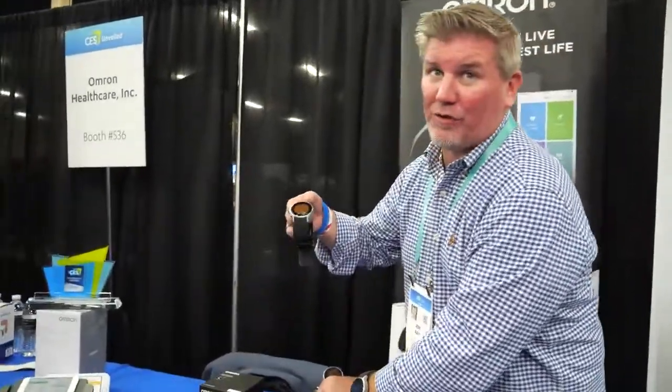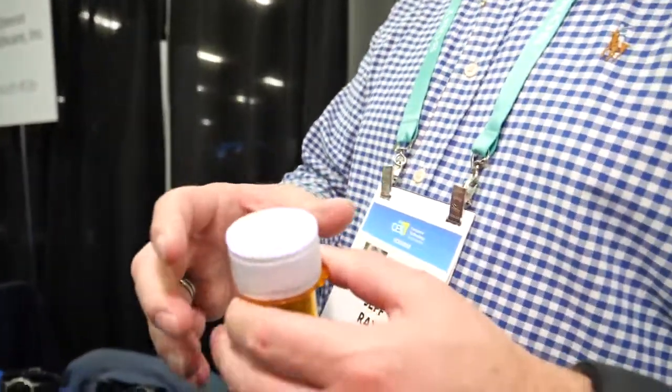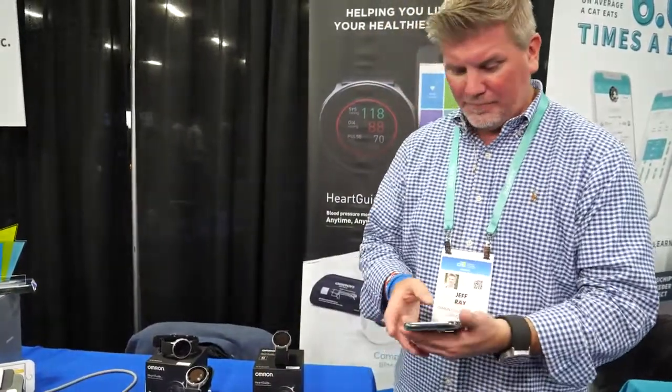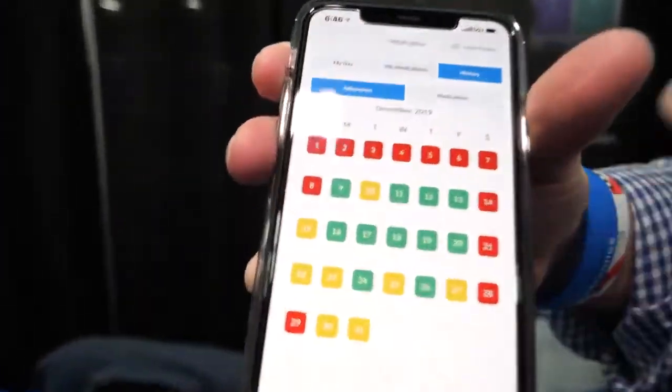Omron also has a new connected pill cap device. The number one reason people have hypertension is non-compliance with medication. The pill cap helps people understand when to take their medication. When used together with the HeartGuide and the mobile application, you can actually see which days you took your medication and which days you skipped it.